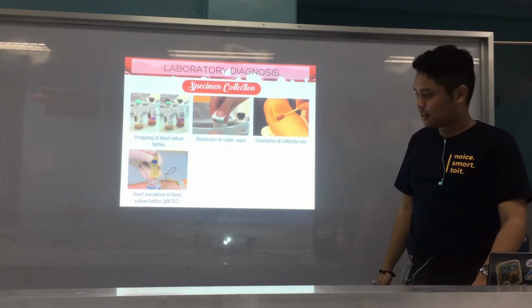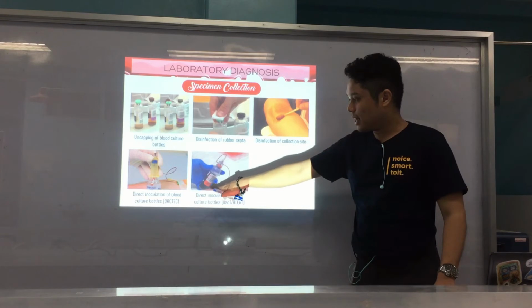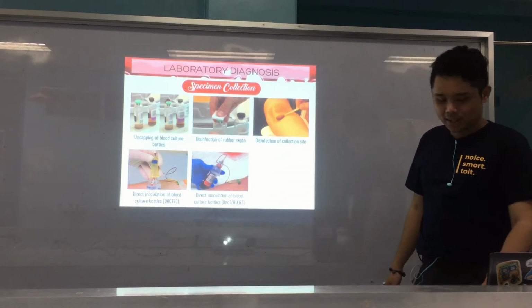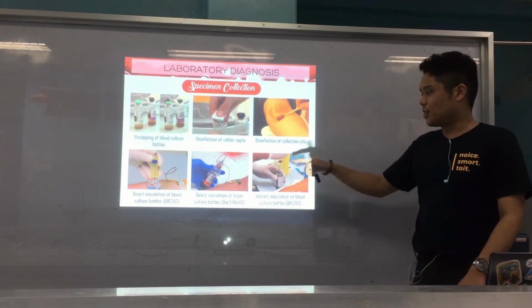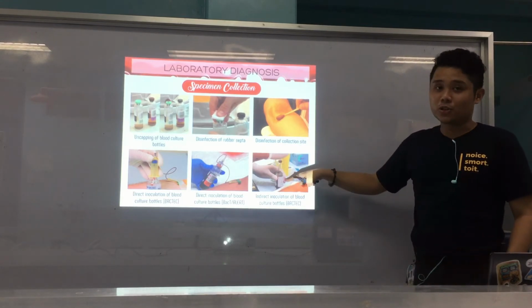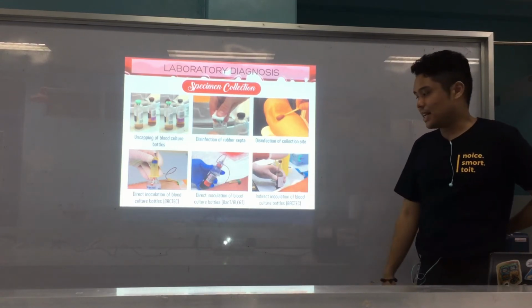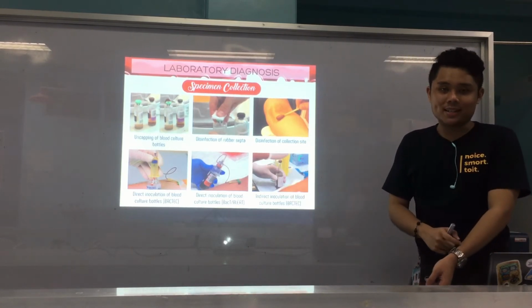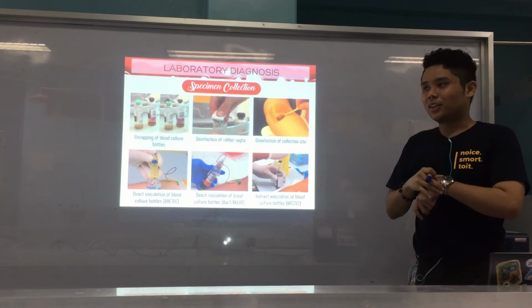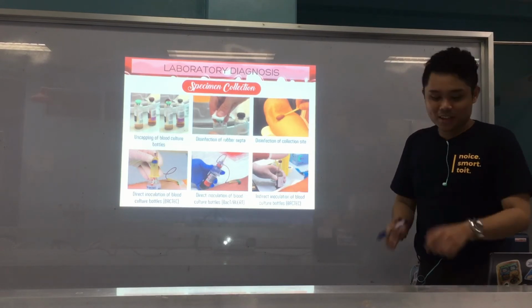Okay? Alright. Tapos, ayan, as you can see, blood diretso na sa culture bottle. Alright? And of course, that's what I've told you, ang syringe, imo siyang ipansak sa imong blood culture bottle. Alright? And then dispense the blood there, depending sa blood culture bottle na manufacturer or brand. Okay, so we'll go to that later. Alright? Okay.